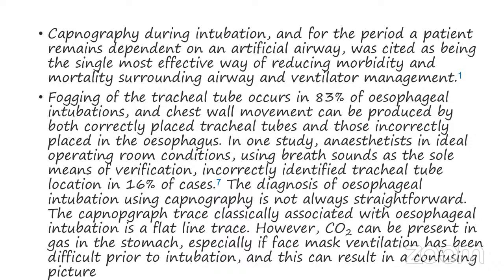The diagnosis of esophageal intubation using capnography is again not always straightforward, and it has to be associated with the flatline trace. However, CO2 can be present in the gas. So we have to wait for 5 to 6 breaths for the confirmation of the correct placement of the endotracheal tube or the tracheostomy tube.